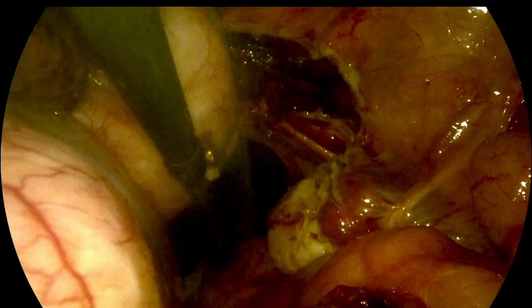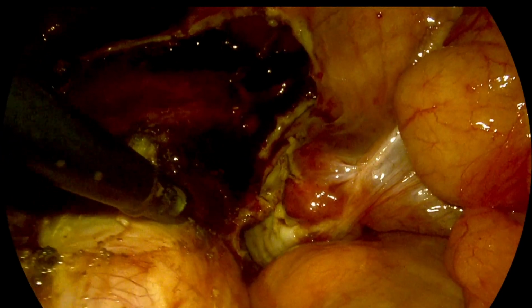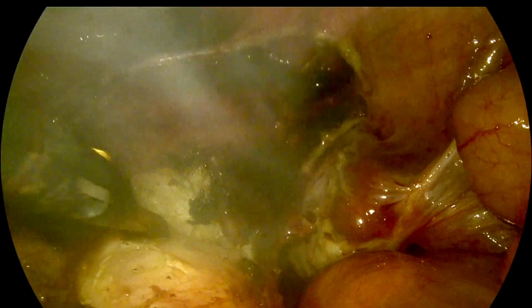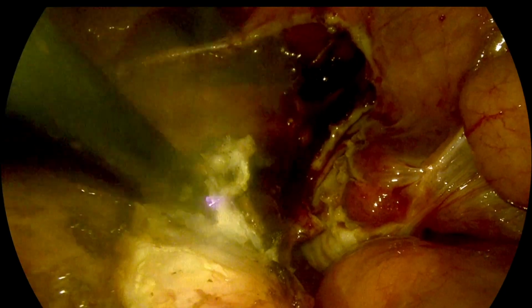Here, the blood vessels will be pushed either anteriorly or posteriorly. Sometimes the vessels will be below the fibroid. Sometimes the vessels are anterior to the fibroid. In this case, we can see the vessel anterior to the fibroid is being coagulated, and then it is divided. So that is the vessel we are trying to coagulate and then divide. Once it is completed, then we can again continue the dissection of the lateral part of the cervix. So this is the uterine vessel anterior to the fibroid near the isthmus.